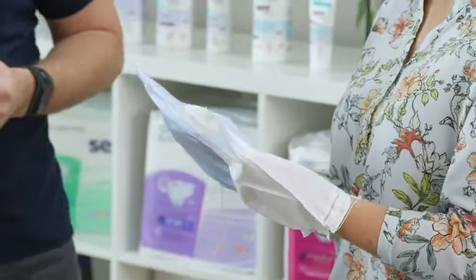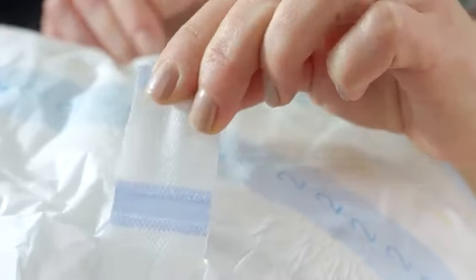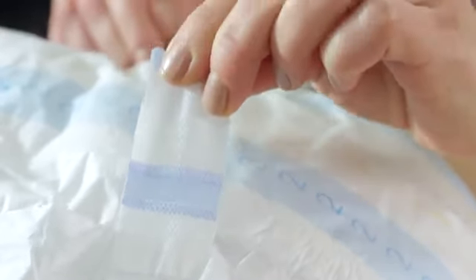Okay, let's sum up what has been said. Today we talk about Super Seni incontinence products. These are the products intended for people in lying position. Thanks to full breathability, they ensure perfect skin safety. In addition, the lack of latex elements means that you do not have to worry about whether the person you look after is allergic to latex or not. Everyone can safely use these products.